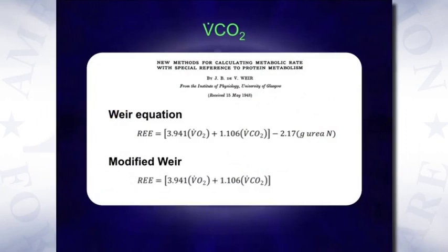So we've kind of transitioned now into a little bit of nutrition, looking at VCO2, and I think this is particularly an interesting area as we spend a lot of time with multidisciplinary teams in our ICUs throughout the country. Here, I'm illustrating to you a couple of ways by which gas exchange is used to calculate energy expenditure in neonatal, pediatric, and even adult subjects.